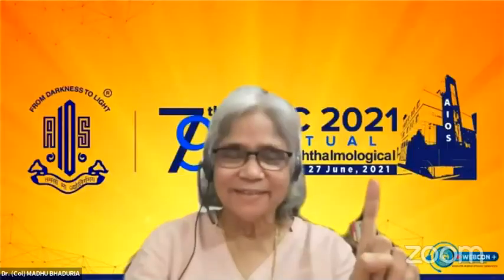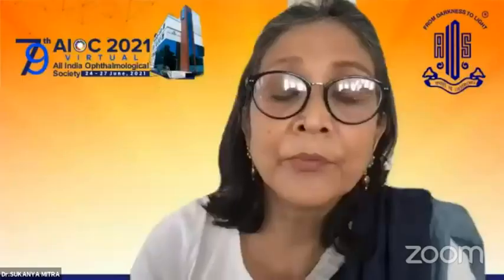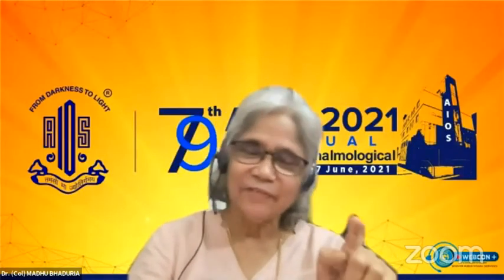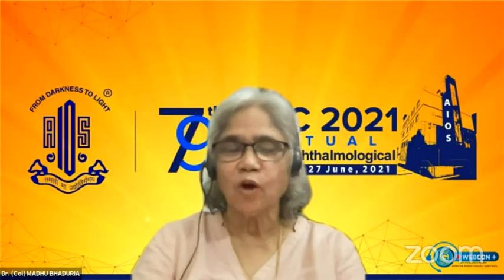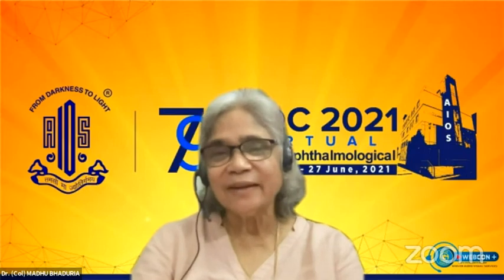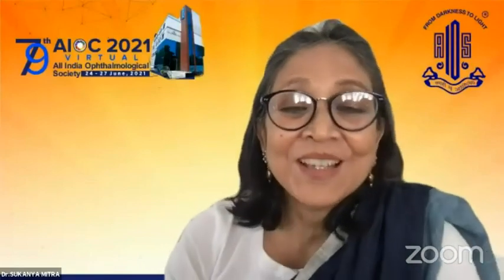There is only one thing where it is useful. I'll tell you one disease: interface fluid syndrome in refractive patients. You can see that actually on OCT, because DLK and IFS both look the same and the treatments are opposite. So it's saying time up, but we still have four more minutes to go. So for IFS, ASOCT is a must, because the treatments are absolutely opposite. IFS will respond to IOP reduction, whereas DLK will require steroids. So that is one, if somebody asks me, I'll say it's an absolute indication. Other than that, that's for the cornea people to do.